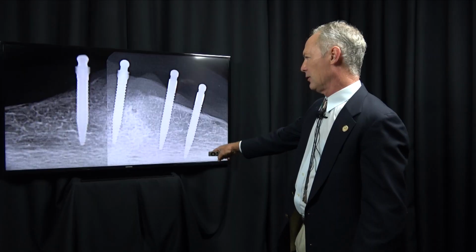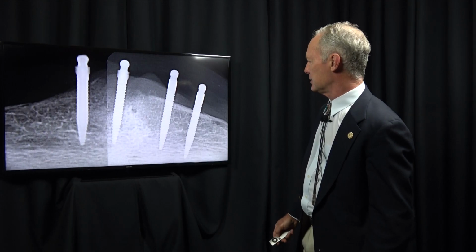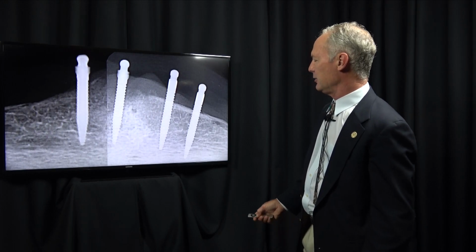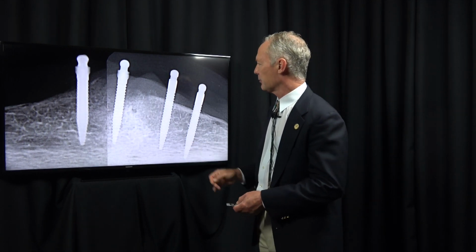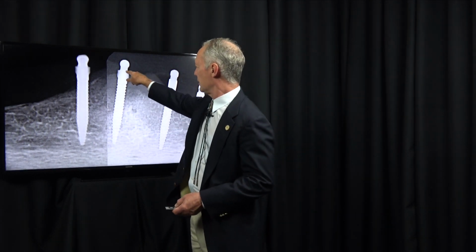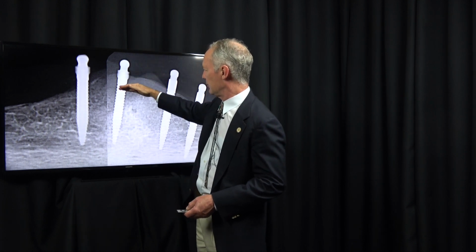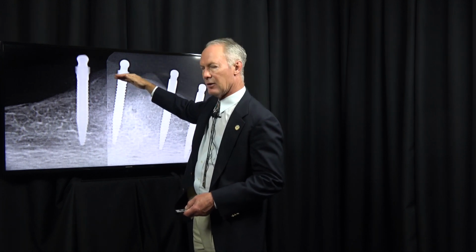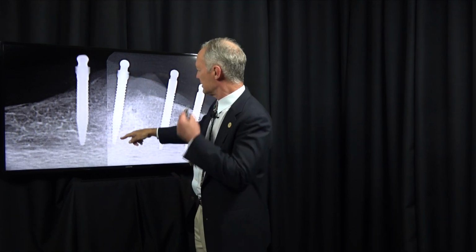You can see where each of these was 15 millimeters. And so we've got lots of stability. Now, how do you know when to stop screwing the implant in? Well, I want the shoulder of the implant to be slightly subgingival. The shoulder of the implant, right here, to be slightly subgingival.